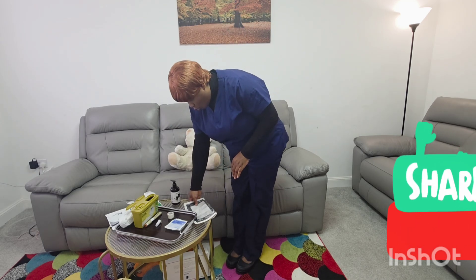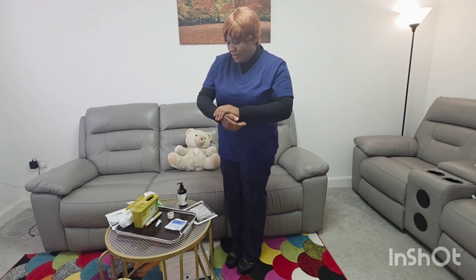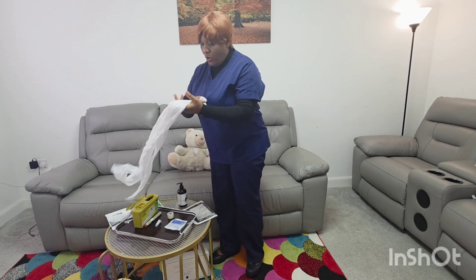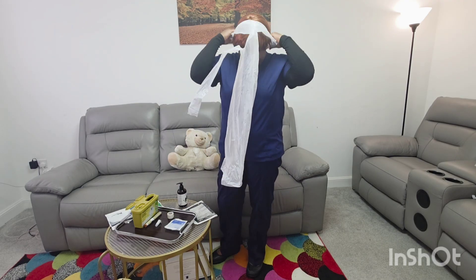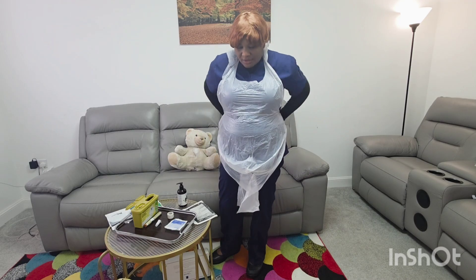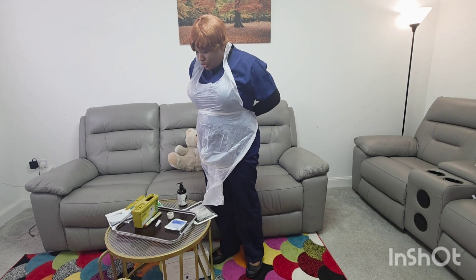Now I'm going to do my second hand hygiene according to World Health Organization guidelines. I put an ample amount of gel in my hands and perform all steps — palm to palm, back of hands, interlaced, interlocked, rotation of the thumbs, tips of the fingers, end of the wrist. My hands are clean. I will put on my apron and tie it to my back. I will quickly put on my gloves.